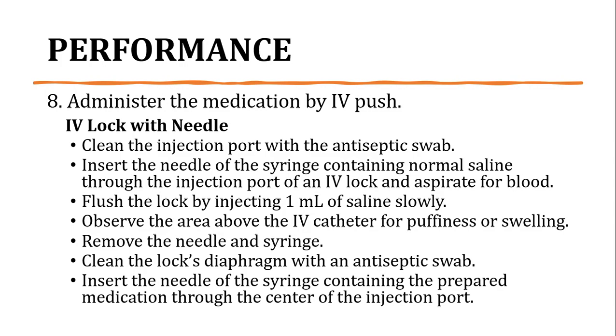Then observe the area above the intravenous catheter for puffiness or swelling, because po kapag merong puffiness or swelling is meaning yan is nagkaroon ng infiltration. Kailangan po i-reinsert yung IV lock sa ibang site para po ma-administer yung medication, tapos ilagay po yung IV lock sa may blood vessel ng client para ma-administer yung medication on the correct route, which is the parenteral.